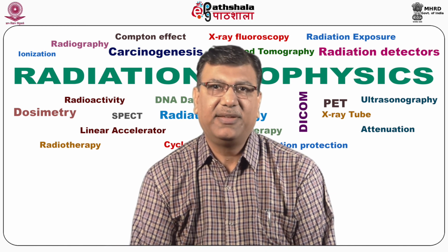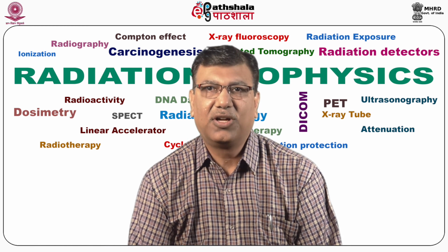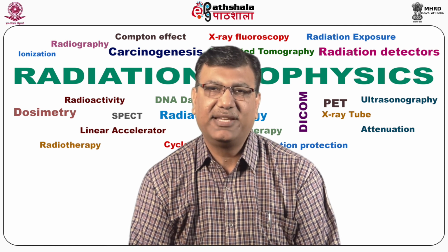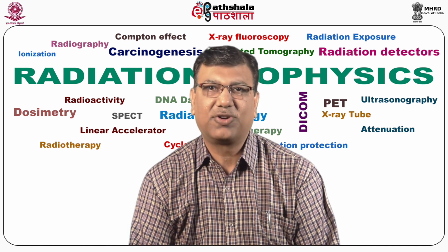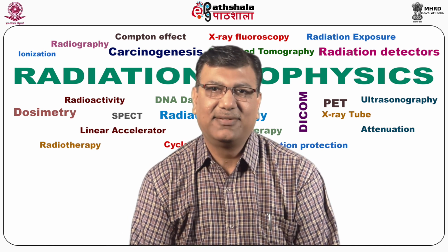Endovascular brachytherapy is for the management of obstruction or blockage in the blood carrying arteries. The modes are bypass surgery and PTCA with stent. Drawback of bypass surgery is patient trauma. More failure cases are seen.